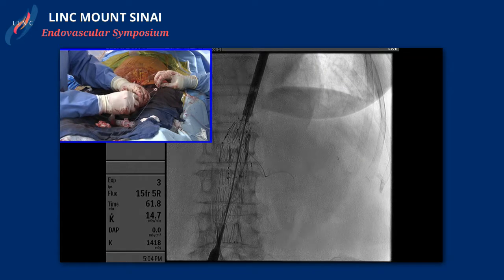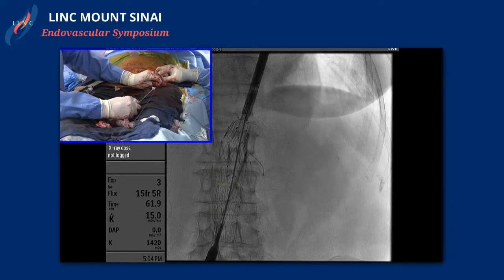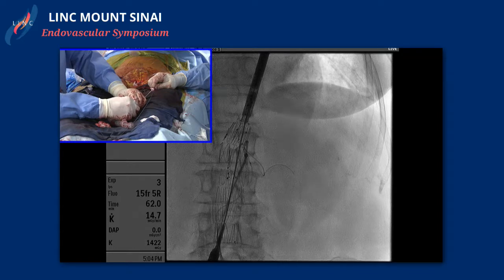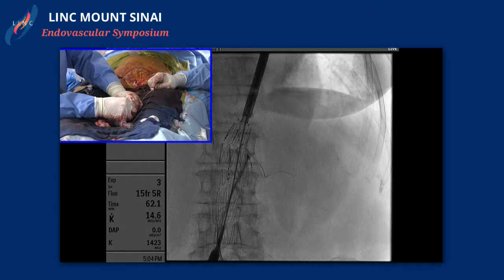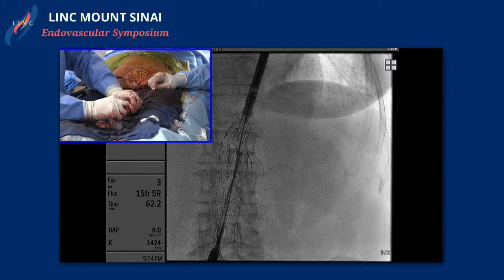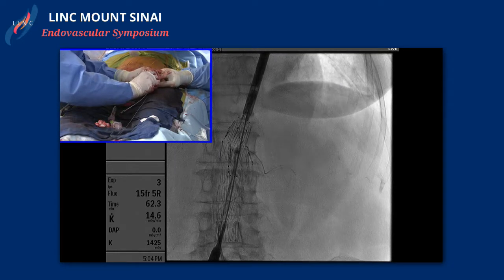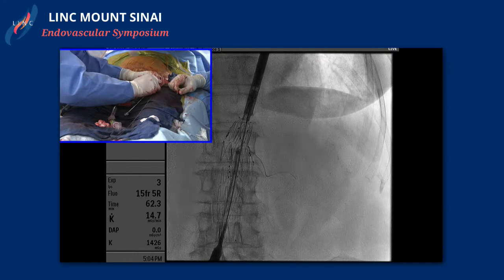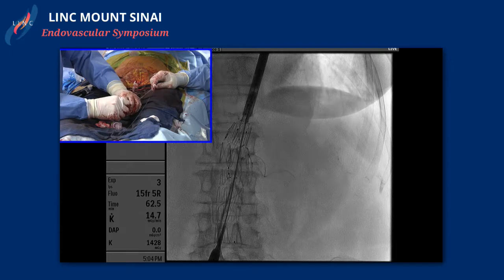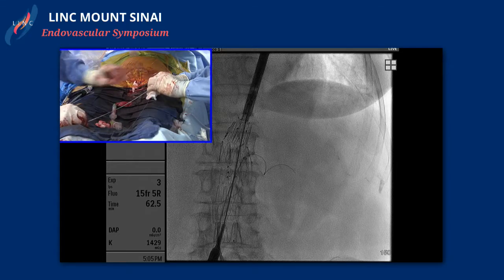We have one of two options really with this. I'm going to bring the sheath up a little bit more, trying to get it close to give me a little bit more support. Having that sheath there sometimes can help you take that extra redundancy out. I see it's flipping up — we're holding our breath here. Sometimes it's the quick pull that kind of gets you there. Hold sheath. Now we've got to rotate the sheath back. What wire are you working with? This is just a floppy glide wire. Now we're going to come back — there we go. I'm going to try and come in with a trailblazer. We have to be careful as we bring this out, Sean — as it comes out, make sure it doesn't pull the wire back.